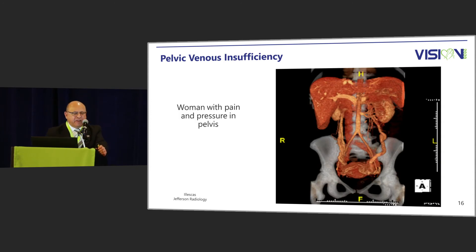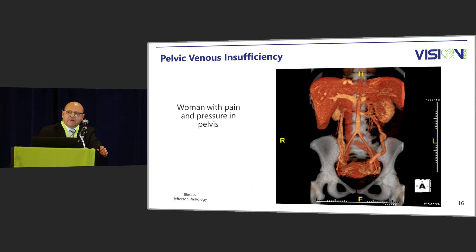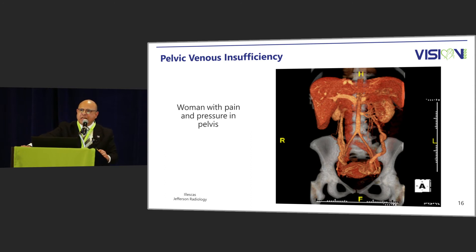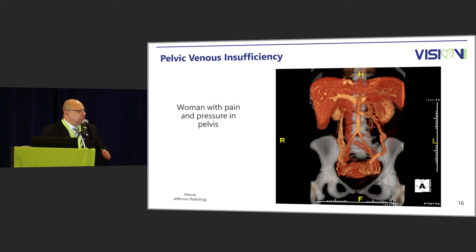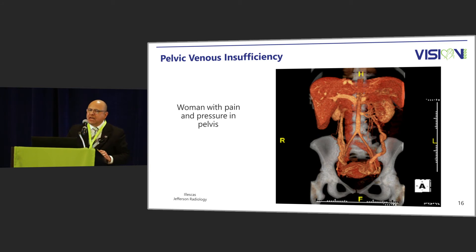This woman has pelvic pain and pressure. On CTV, both arterial and venous anatomy are demonstrated. Focusing on the left gonadal vein, you can see there is a 360-degree loop — I would challenge anybody to navigate that blindly in an efficient time. On the right gonadal vein there are multiple branches, which must be accounted for during embolization.